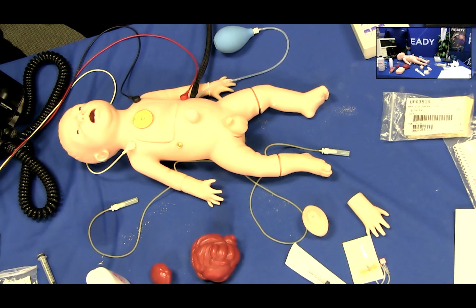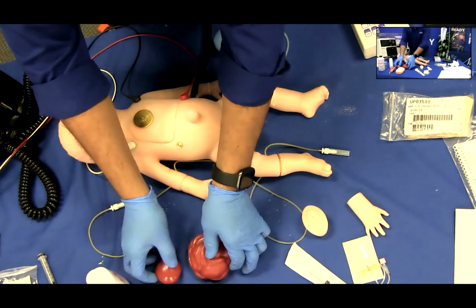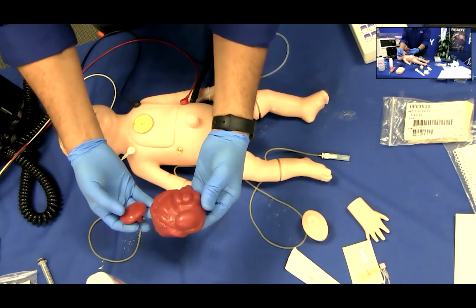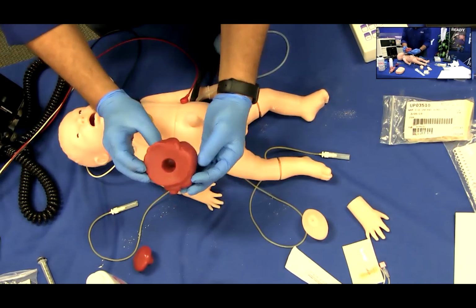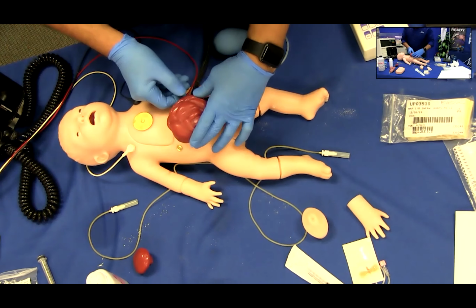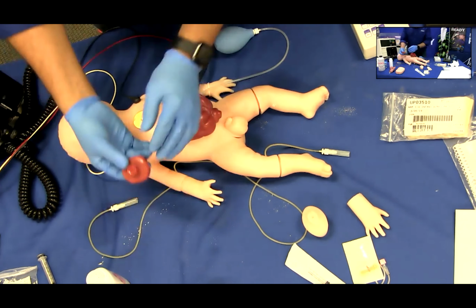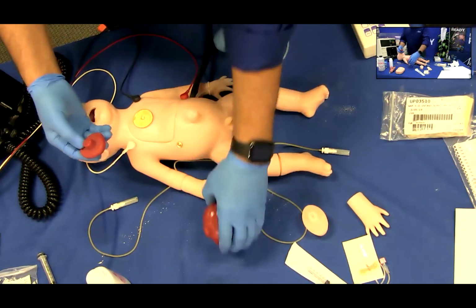Defects. 2 birth defects are included with C.H.A.R.L.I.E: an omphalocele birth defect that fits over the patent umbilicus, and the neural tube defect that fits into the hole on the back of the infant simulator.